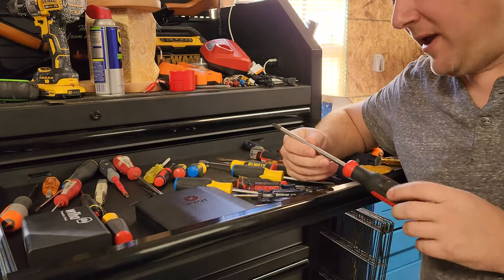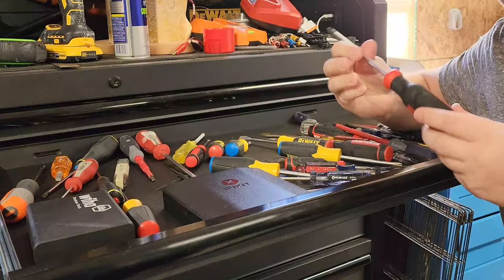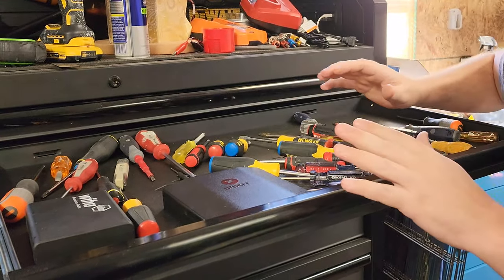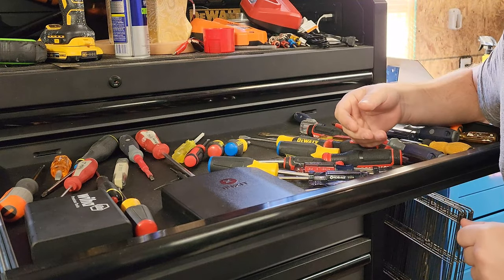Hello everyone and welcome back to Better Biomed. Today we're going to cover another Biomed Basics video. This time it's going to be about screwdrivers. There are many different types of screwdrivers and you think you might know the uses for all of them, but maybe you don't. Let's go ahead and check it out.